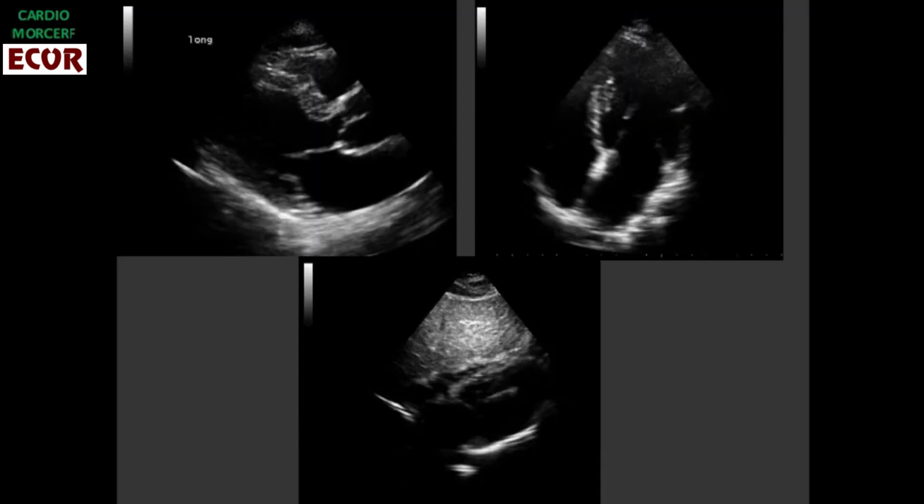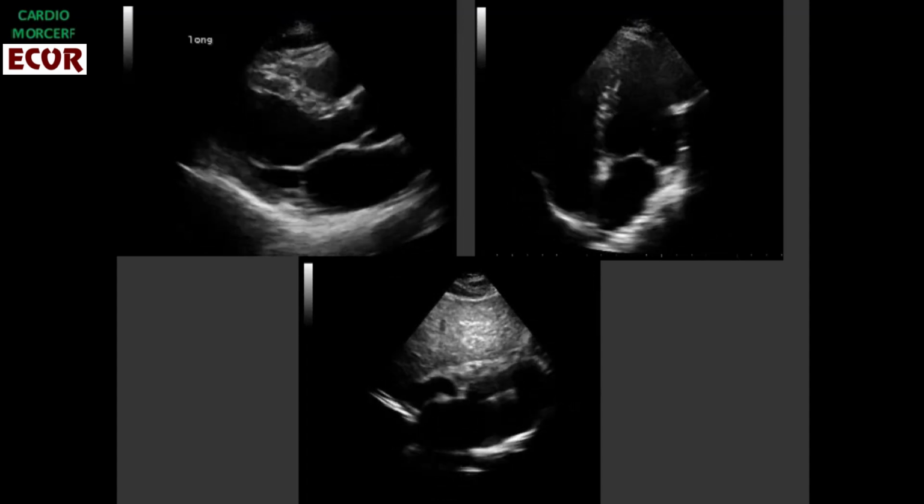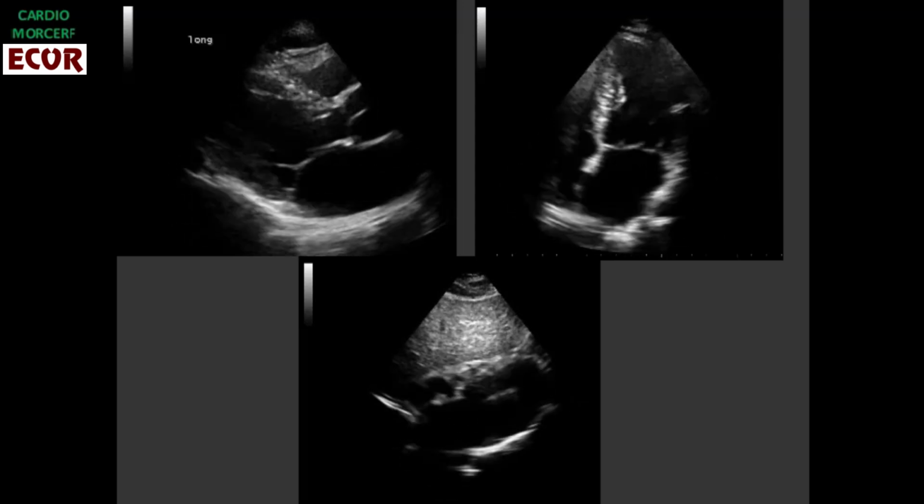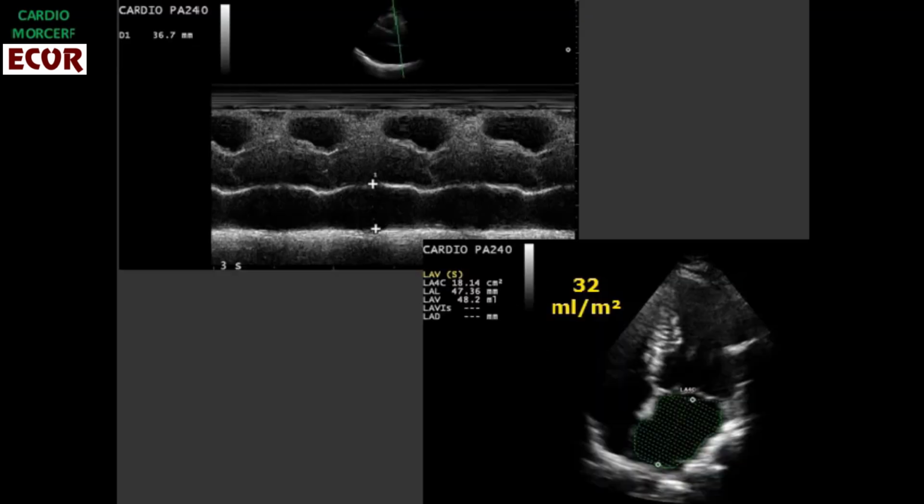In the first one, the parasternal long axis, the left atrium looks mild to moderately enlarged. In the apical four chamber, it seems normal size, and in the subcostal, normal to mild. I would suggest you make up your mind by eyeball whether it is dilated or not, then get the measures. Notice that it is easy to recognize degrees of left atrial enlargement with no measures and independent of body surface area if you keep the same structures and cavities with the same disposition within the triangle of the scan. Then the triangle becomes the rule and the guideline for comparison.